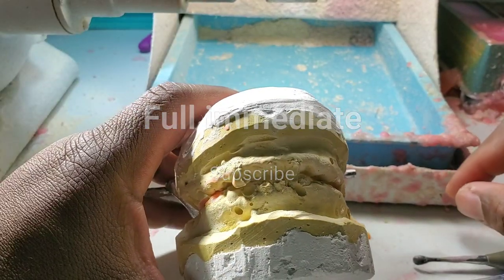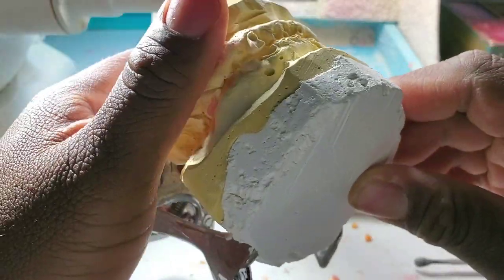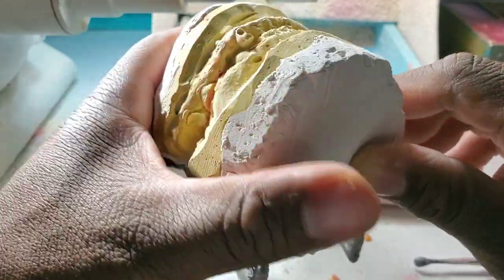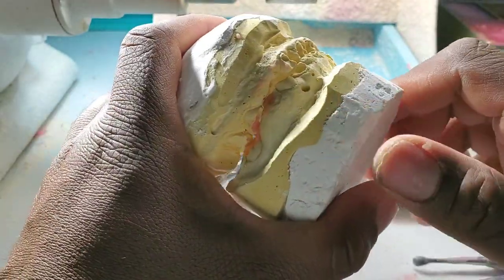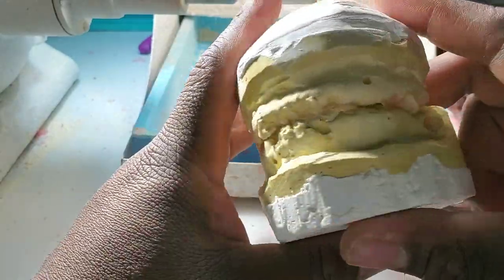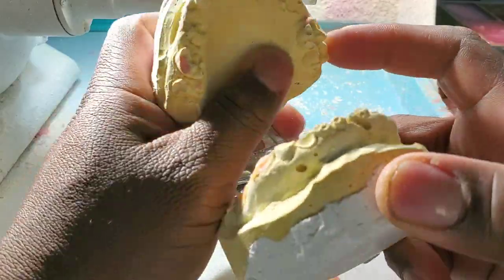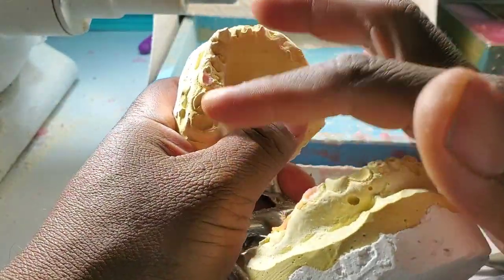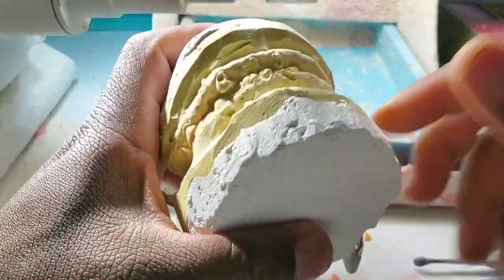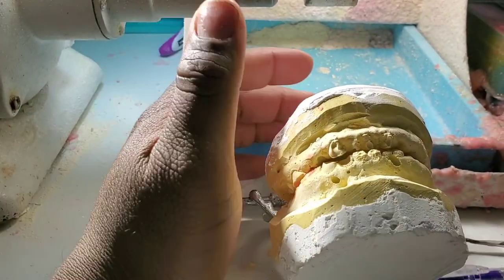Have you ever wondered how immediate dentures are made — how people can walk out of the dentist with dentures already made for them? In this case the person still has all the roots and some broken teeth, upper and lower. I'm going to show you exactly how immediate dentures are made. It's kind of a simple but slightly long process.